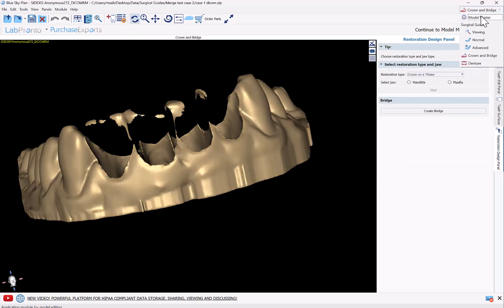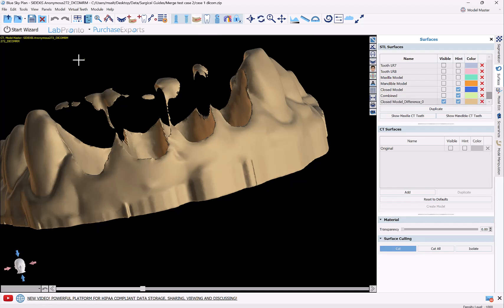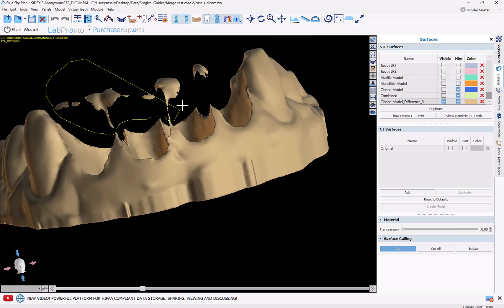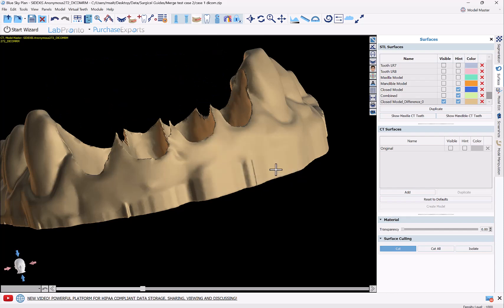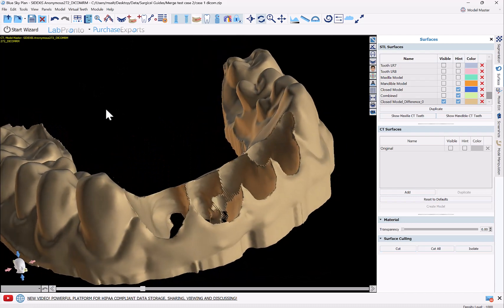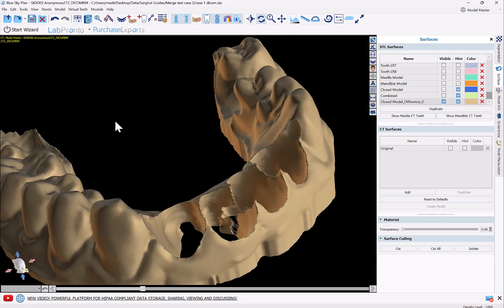What we can do is revert back to Model Master, go to our surfaces panel, select the relevant surface, and then use the cut tool and just draw a lasso around what you want to remove. We'll go ahead and cut out those remaining pieces, and we're left with our model with the extracted teeth.